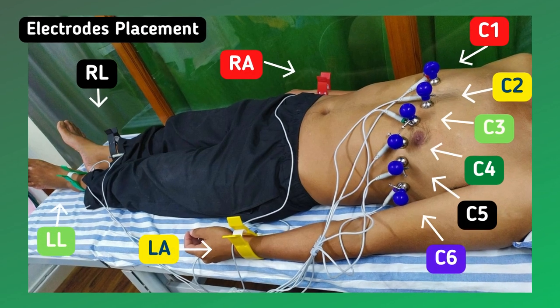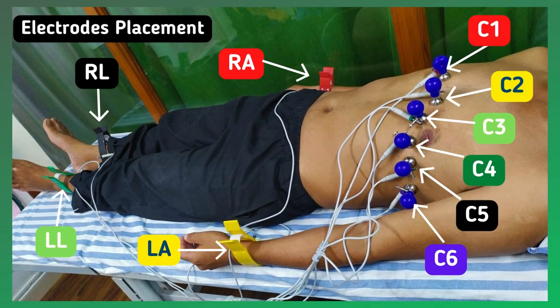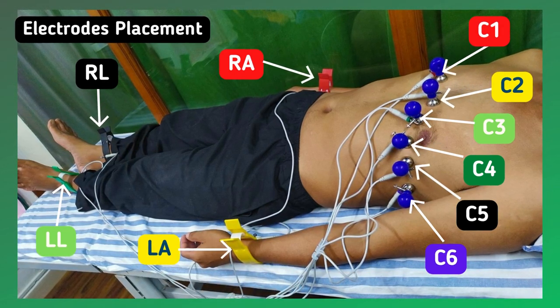The final electrode placement will look like this. Once all connections are done, turn on your ECG machine and it will start recording the ECG.